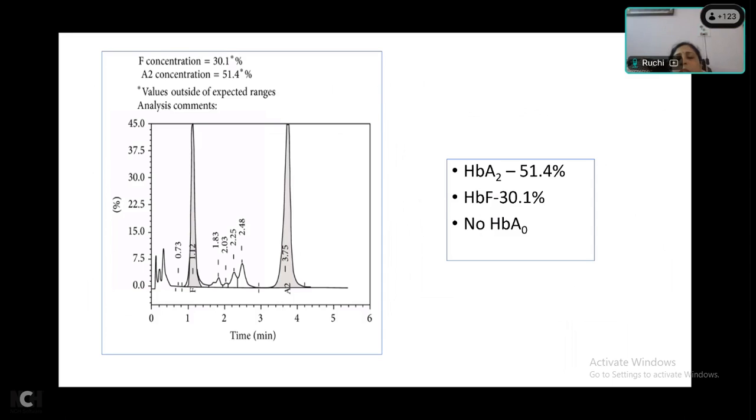हाँ, अभी तुमने मुझे बताया ना पेशेंट बंगाल का है तो तुम कंपाउंड हेट्रोजाइगस HBE E beta क्यों नहीं सोच रहे? I said E beta initially. अच्छा, okay, you said E beta compound heterozygous, HBE E beta, Iran, and Right. So how do we now solve the problem? And we can also look at the parental HPLCs.